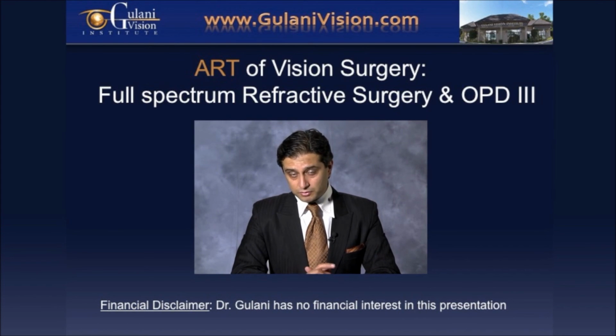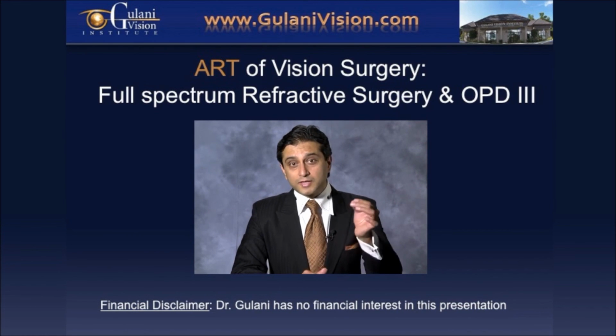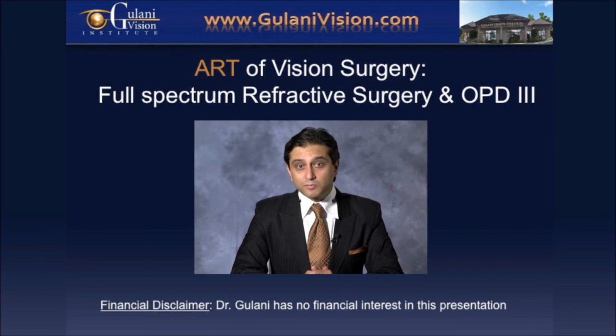message from this presentation. Not only to do those routine cases that we do, LASIK and cataract, but take it to the premium cataract surgery cases, take it to those unhappy premium cases who can be helped, take it to those cases who you say no to. There is a way to help them.